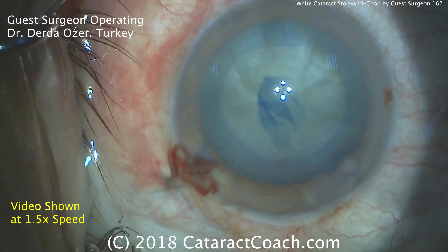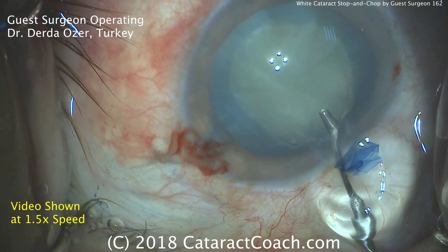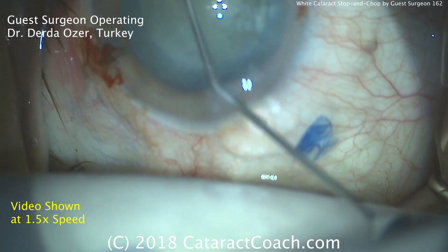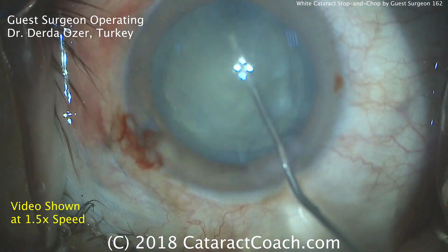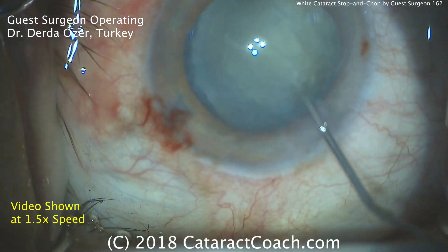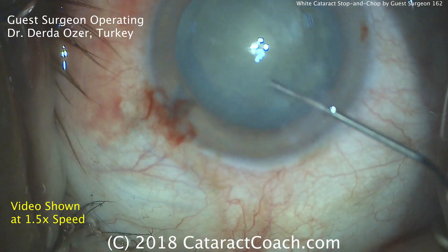Time for hydrodissection — nice and gentle, going under the rhexis edge, and that looks really good. This is certainly a denser cataract, not an absolute rock, but a white cataract with a significant degree of nuclear sclerosis. The lens does rotate, which is an important move — the doctor is rotating the lens nucleus, making sure it's free in the capsular bag.